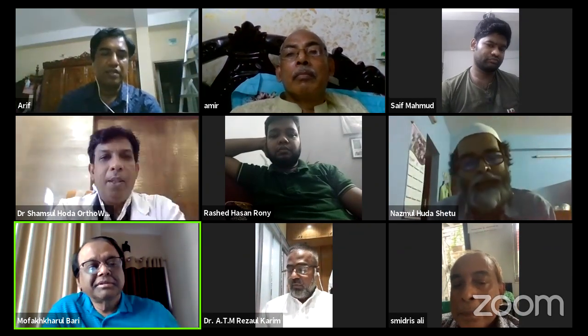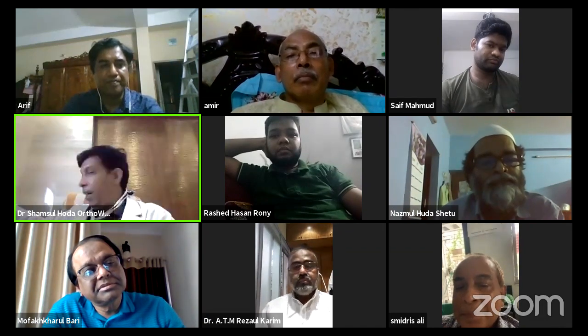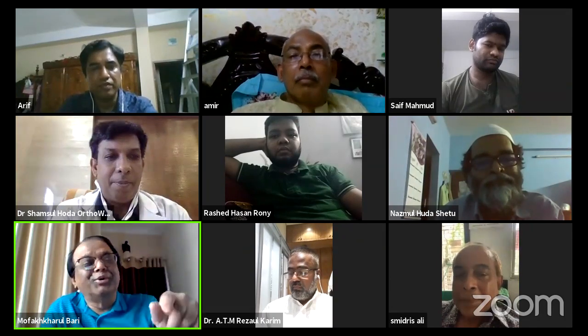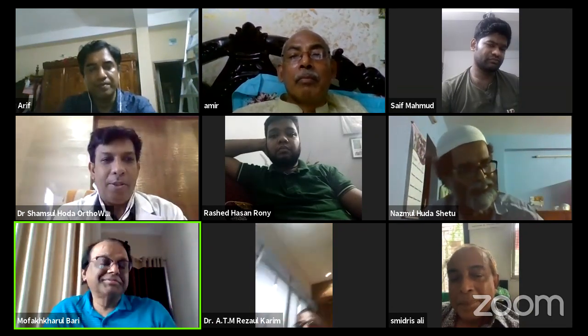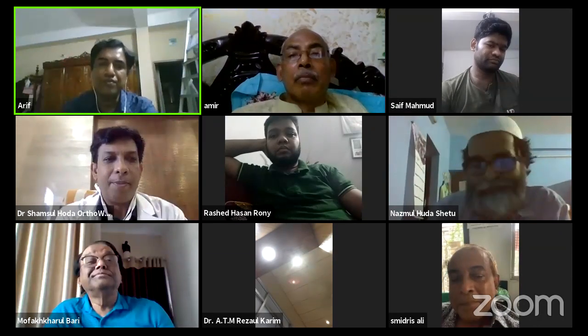Yes, hello? Yeah, hello, Dr. Arif. We have hydroxyapatite coated Schanz pins available. I'm not very sure about the ILIZAROV wires. So far as I know, no. Yes, hydroxyapatite Schanz pins are available, but K wires, no.